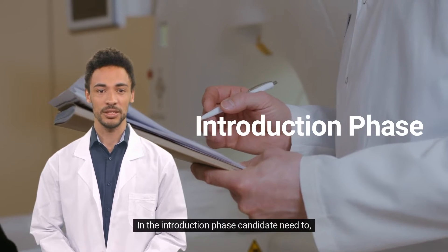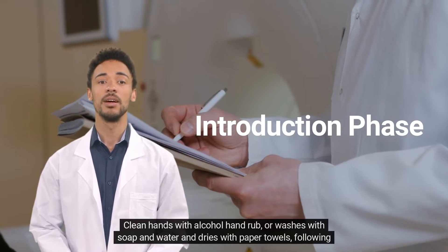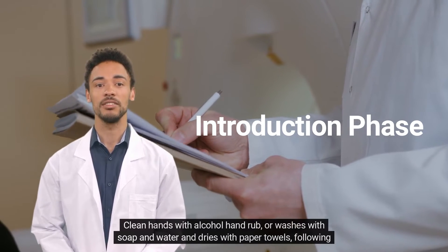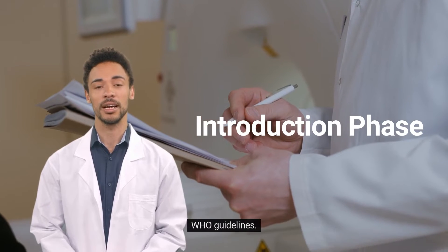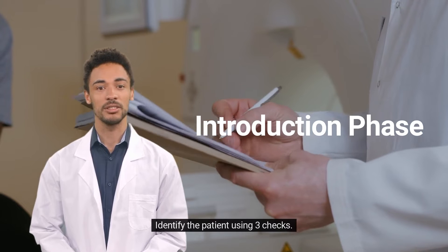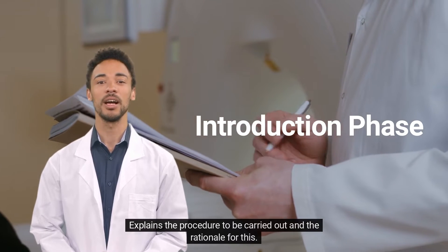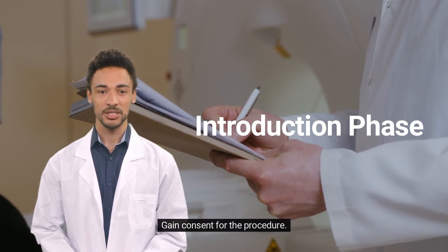In the introduction phase, the candidate needs to clean hands with alcohol hand rub or wash with soap and water and dry with paper towels, following the guidelines. Introduce yourself, identify the patient using three checks, explain the procedure to be carried out and the rationale for this, and gain consent for the procedure.